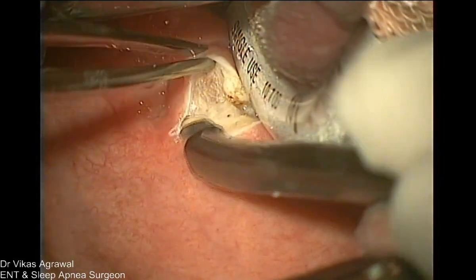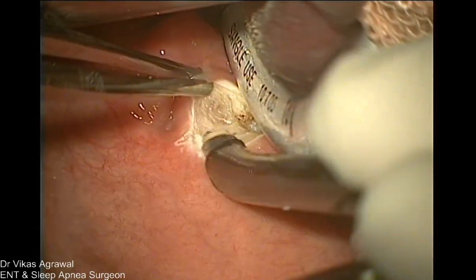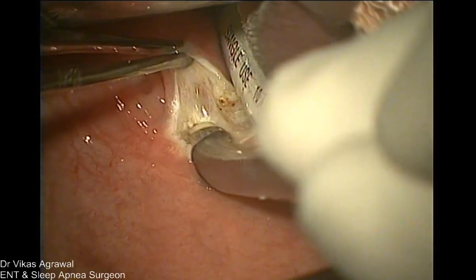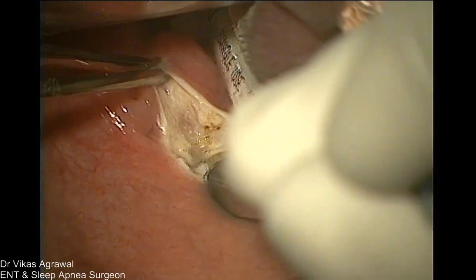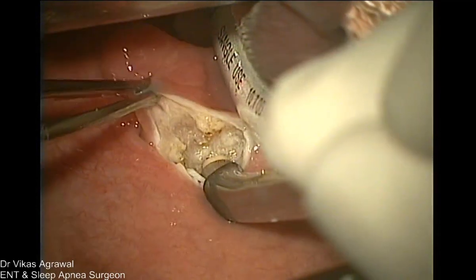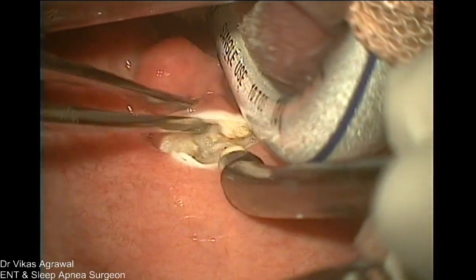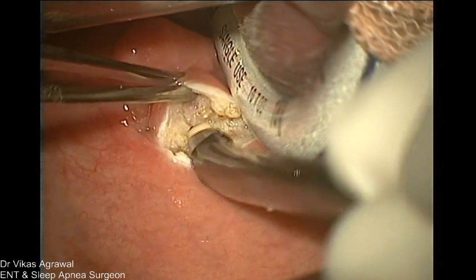Now, this is what you see. There is a bloodless field with coblation, and you can see that there is no charring. And that's the most important point. If there is no charring, there will be almost no fibrosis at the cut edge of the palate. If there is fibrosis here, it will act as a fibrotic band which will not let the palate move up. Now this is the musculus uvuli.